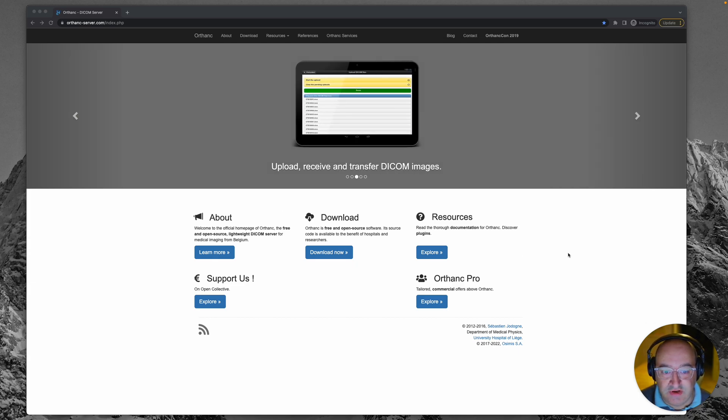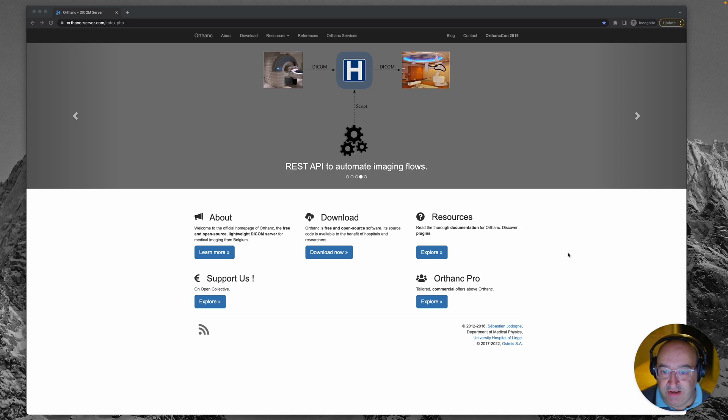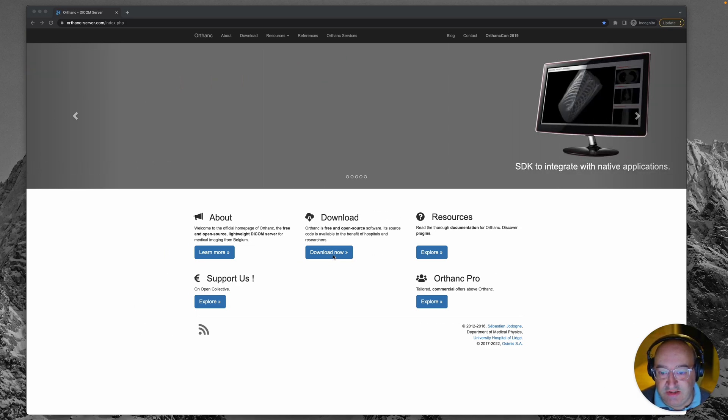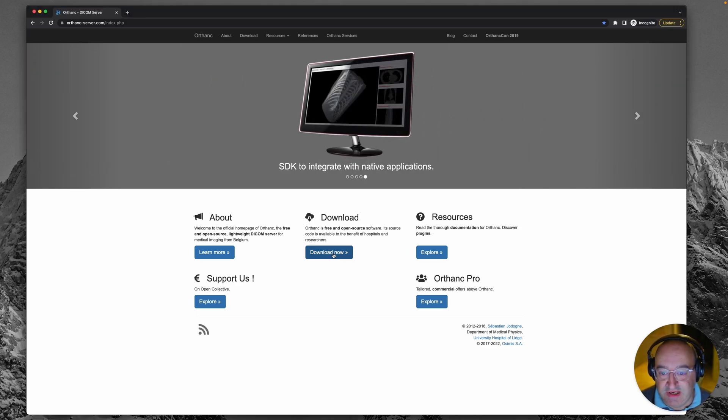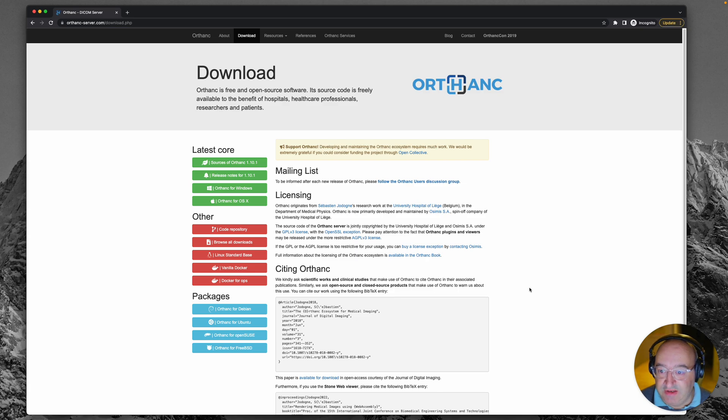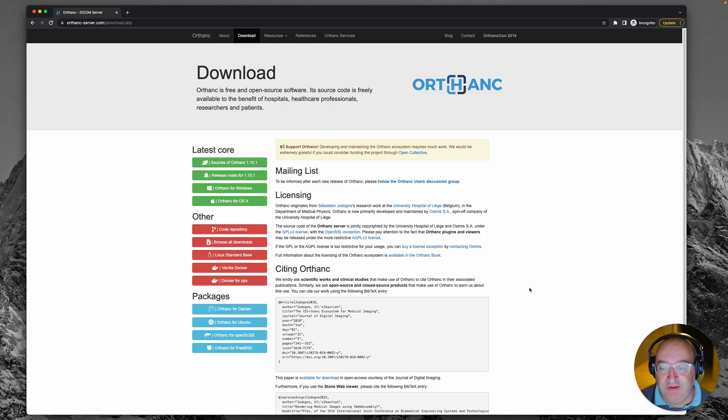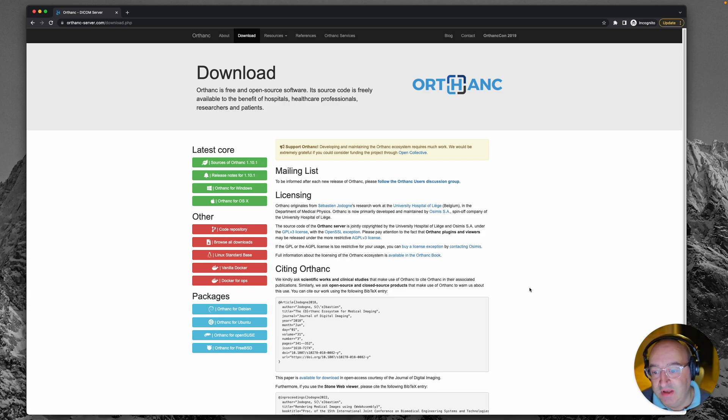So to do that I'm going to be installing Orthanc in a server situation, and if you head to the downloads page you can see all of the different versions that there are. If you'd like to just play around, then by far the easiest thing to do is to download one of the install packages like Windows or OSX, as they really do a lot for you and they come with all of the plugins so you can try it out.